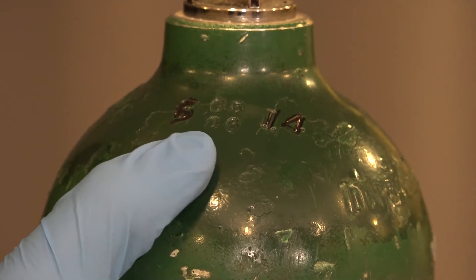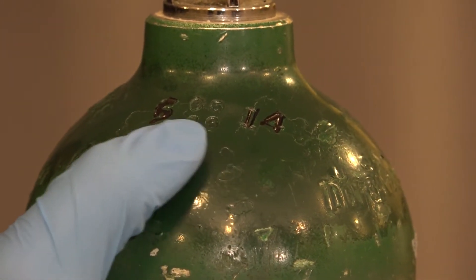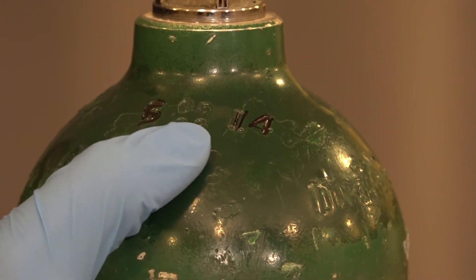Looking at the top of the tank, we look for the date. This one was tested 5 of 2014 — it says 514. It's good for five years, so it will be good until May of 2019.